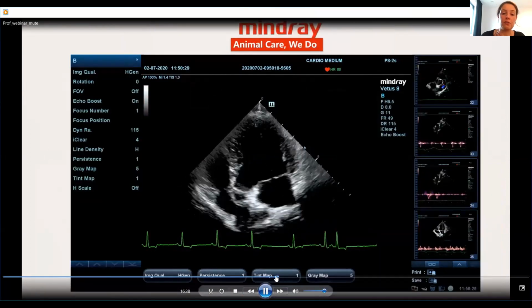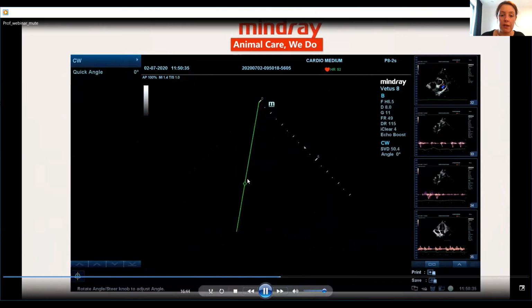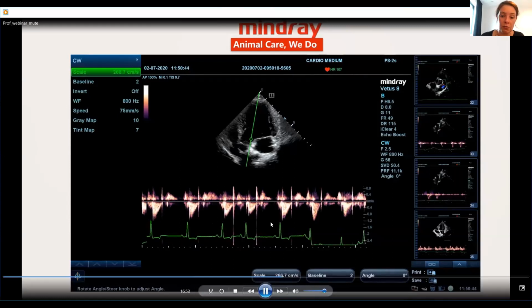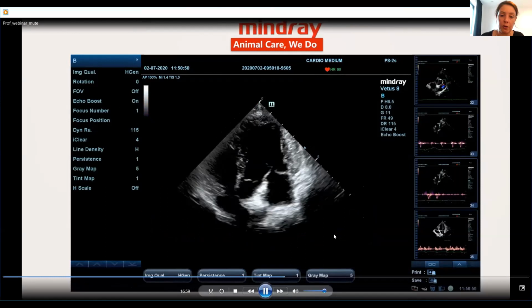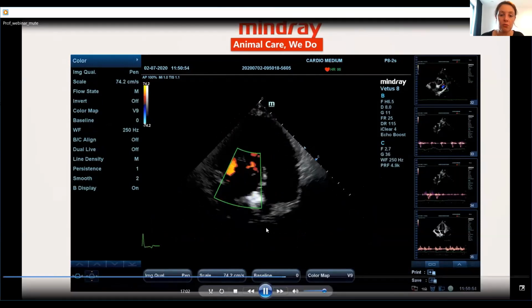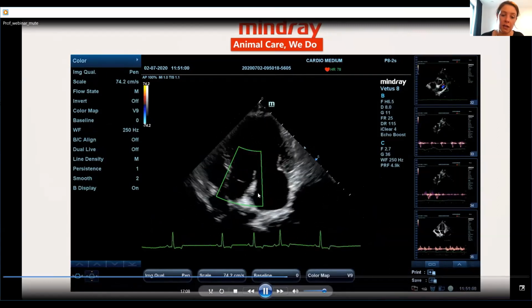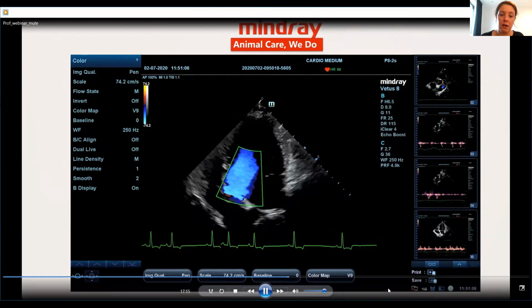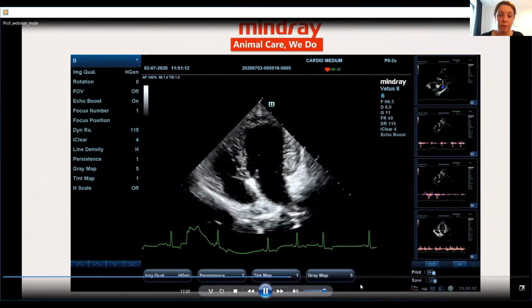Yeah, so now we are moving on to the left apical 5-chamber view. We have our aorta here, and this is again the continuous wave Doppler. What I'm doing is putting the continuous wave Doppler in the aorta. When your dog is moving, you can move from your 2D image to your color Doppler, to your continuous wave Doppler image to correct the angle of your cursor. This is then the color Doppler on the aortic valve. We don't actually see significant insufficiencies or turbulent flow. We also didn't expect it because the dog has no heart murmur.